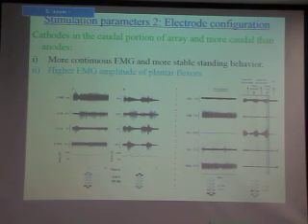But probably the most difficult part is related to the selection of the electrodes that are active. There are 16 electrodes that can be set in 3 different states: active, non-active, cathodes, or anodes. So far there are just guidelines that we have provided recently, but there is no fixed rule on how to select those. What we know is that cathodes placed more caudal than anodes usually provide a more stable pattern, with the distal muscles and mainly the plantar flexors more active.